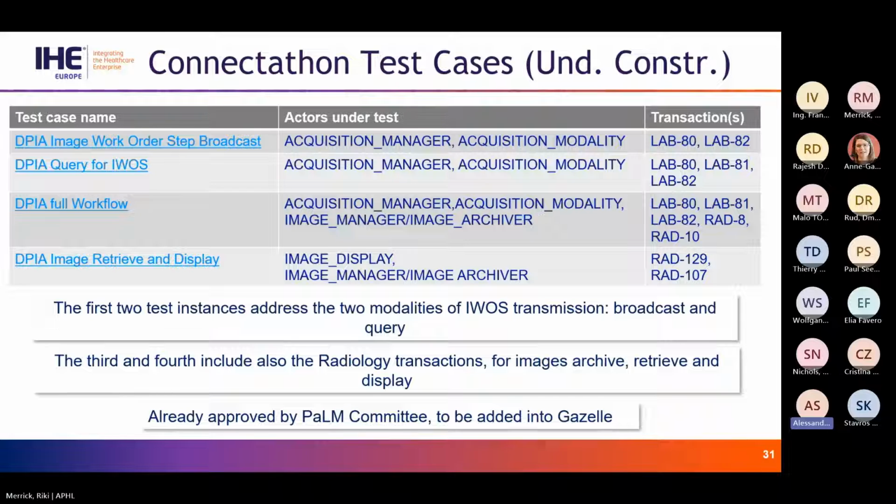There's been already a first iteration of these test cases, so I think that they are almost ready to be included into Gazelle. For those of you that are not familiar with connectathon testing, mainly each profile has a number of tests that each vendor has to perform at the connectathon.